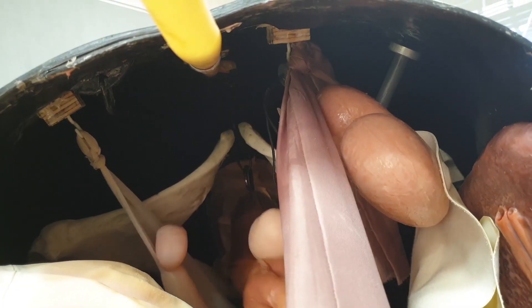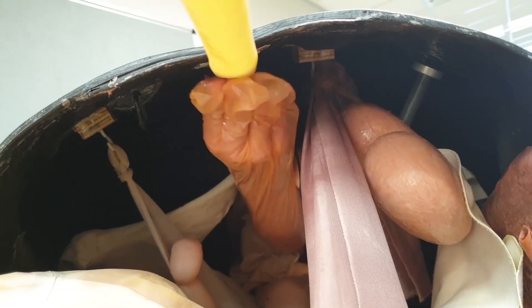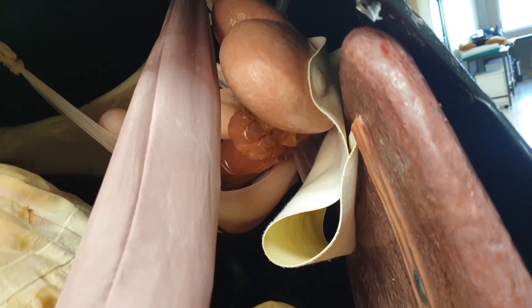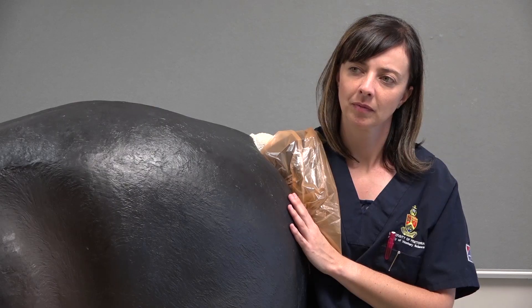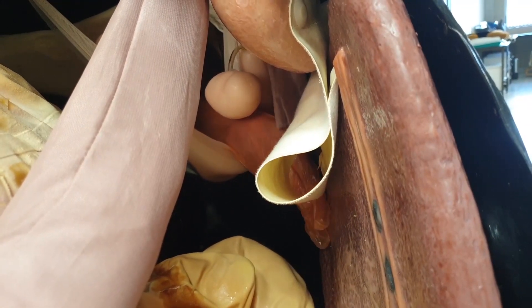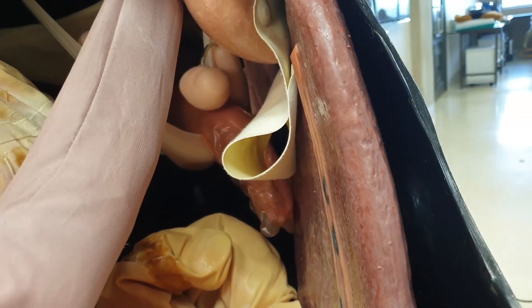Palpate the aorta. Palpate the caudal pole of the left kidney. Palpate the nephrosplenic ligament. Palpate the caudal edge of the spleen.